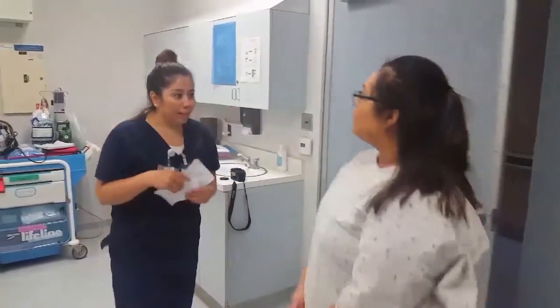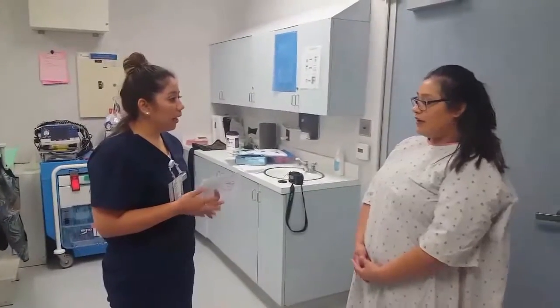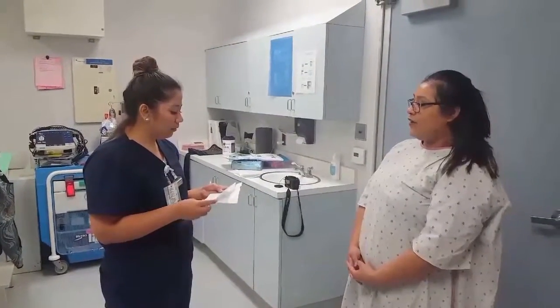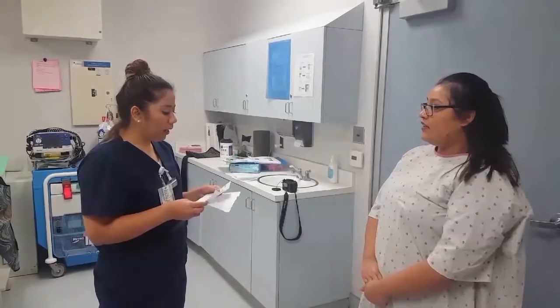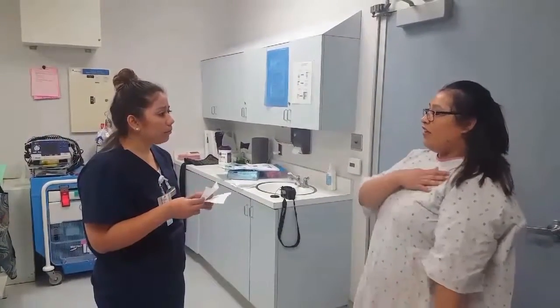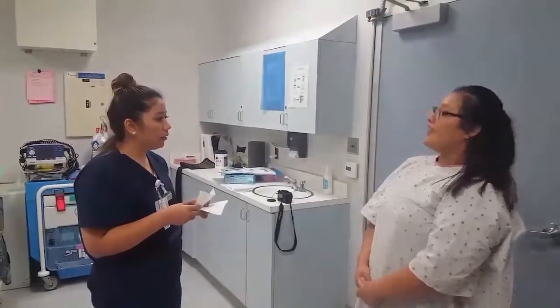Hi, my name is Blanca. I'm a radiography student, and today I will be doing the exam for you. Okay, and can I have your full name, please? Yes, Miriam Garcia. And your date of birth? August 23rd, 1993. Okay, and what brings you here? I fell a couple of days ago. Okay, and from my understanding, it's your right shoulder. Yes, it's my right shoulder.